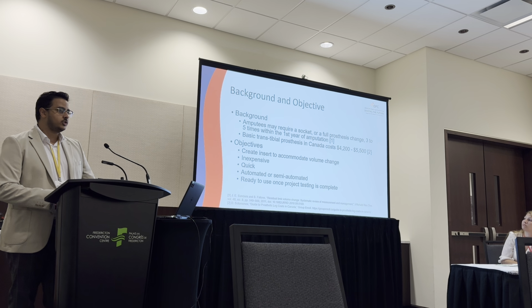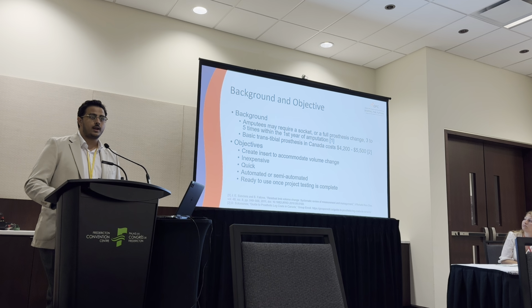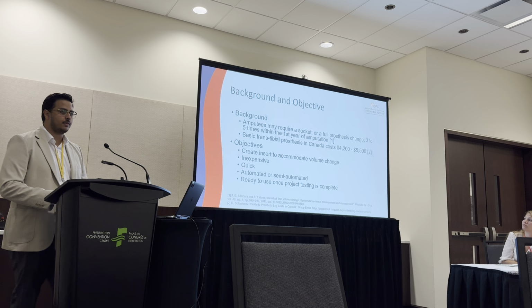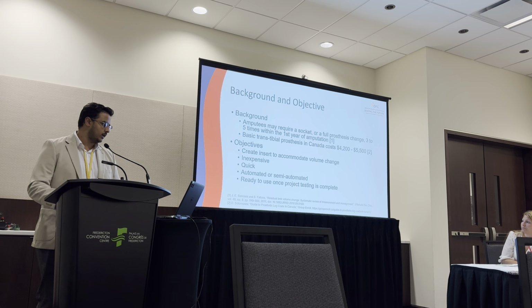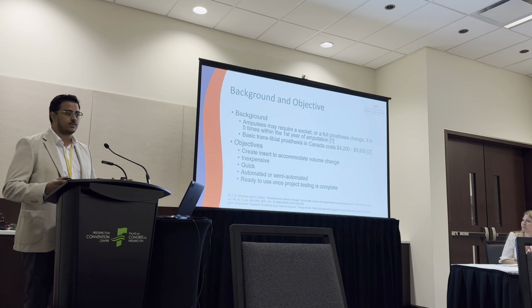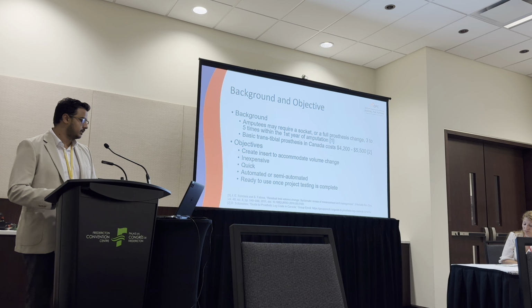Our goal in this project was to resolve this issue without compromising on the quality of care, while creating an inexpensive and cost-effective solution to try to alleviate some of that financial burden on both the amputee and the healthcare system that sometimes subsidizes these sockets. We also wanted to create a quick solution to alleviate some of the time restraints on prosthetists and amputees, the wait times to get their sockets.